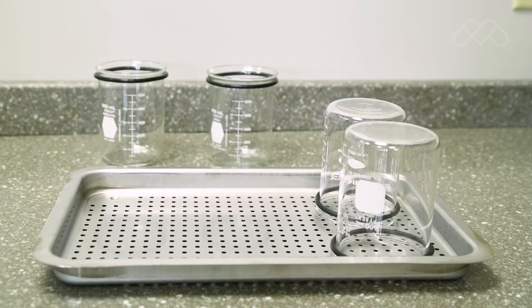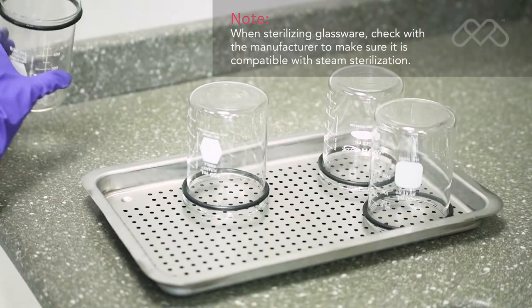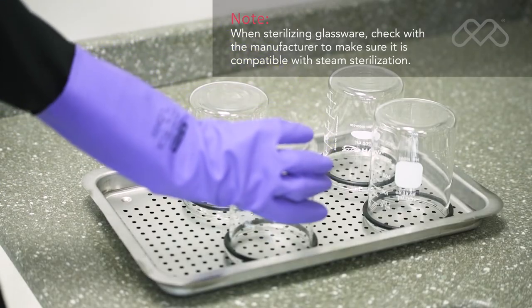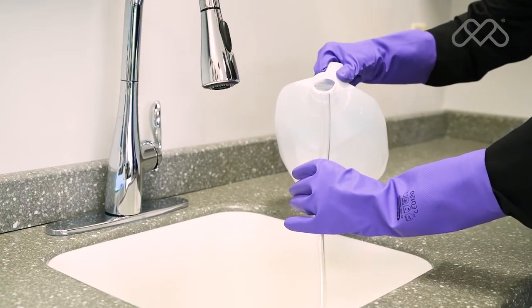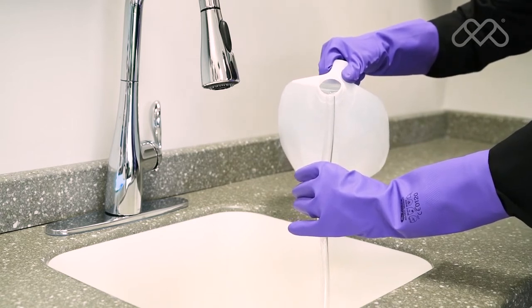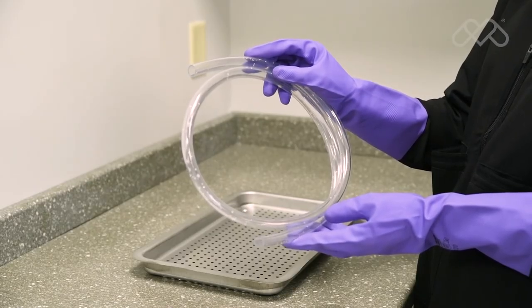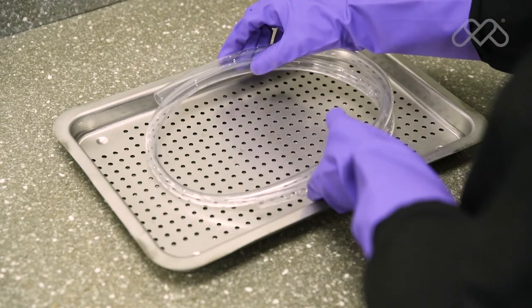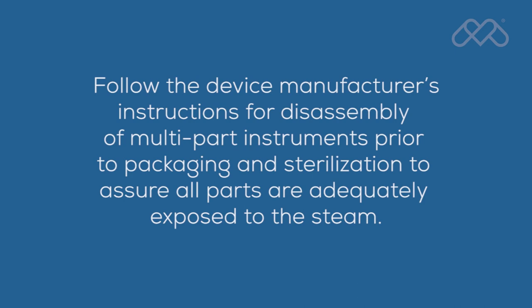Hand pieces and instruments must be arranged in a single layer on the trays, not piled or stacked, to permit proper steam flow and drying. Glassware or utensils capable of holding water should be positioned on the tray with the open side down, so any water condensate drains from the container. When sterilizing glassware, check with the manufacturer to make sure it is compatible with steam sterilization. Rinse tubing with distilled water or water that meets the referenced water purity specifications in the user guide, and do not dry prior to sterilizing. Arrange tubing on the tray so there are no sharp bends and the tubing ends are open and unobstructed. Follow the device manufacturer's instructions for disassembly of multi-part instruments prior to packaging and sterilization to assure all parts are adequately exposed to the steam.